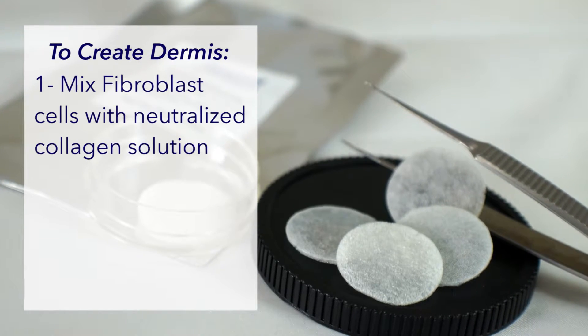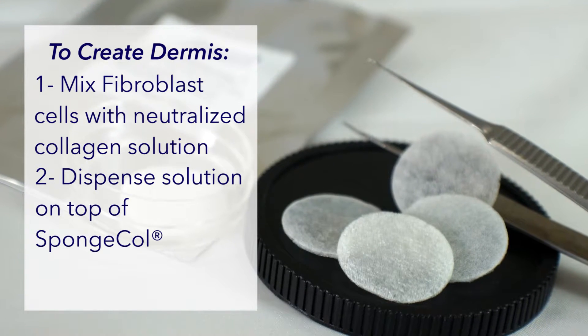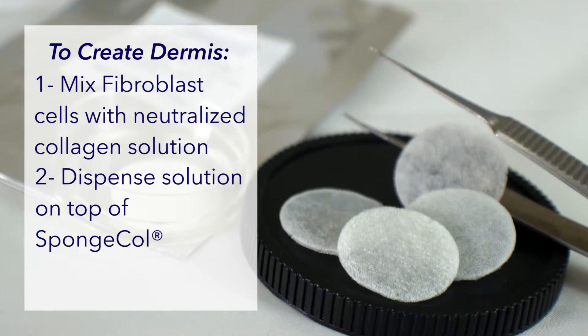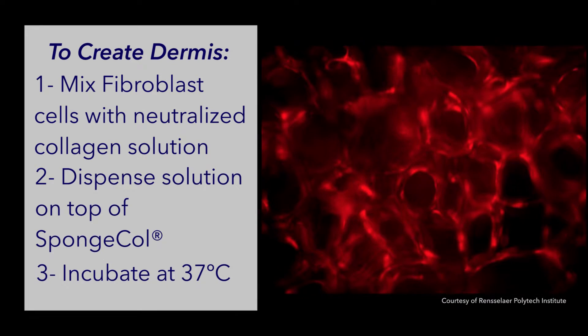Fibroblast cells can be mixed with a neutralized collagen and then pipetted on top of SpongeCol. The collagen solution and cells will disperse down into the sponge. SpongeCol can then be incubated at 37 degrees and the neutralized collagen will form a gel within the sponge. The cells will proliferate, grow and produce their own extracellular matrix proteins within the pores and then remodel their environment to mimic the dermis of skin.